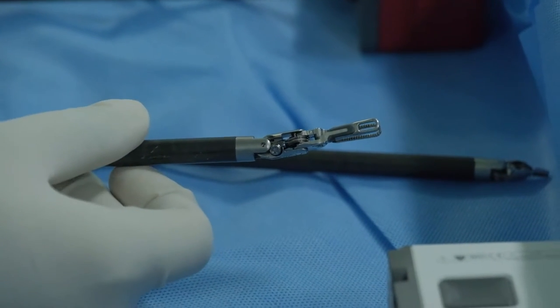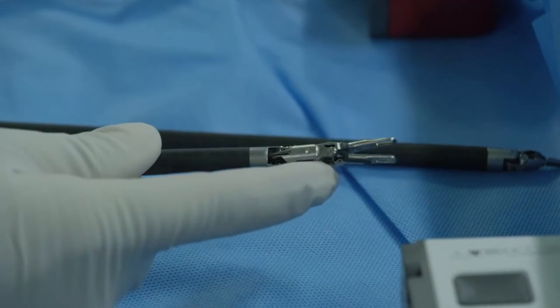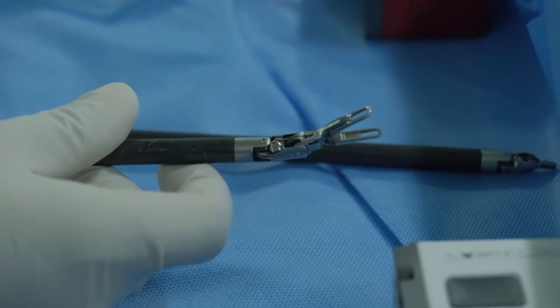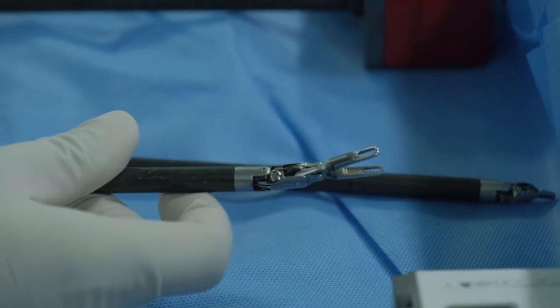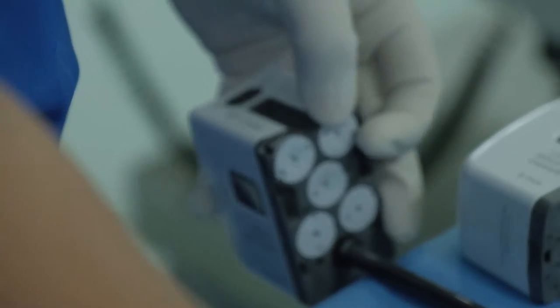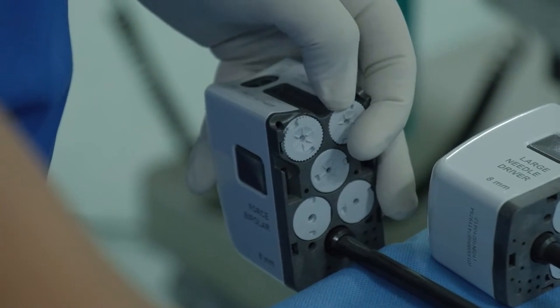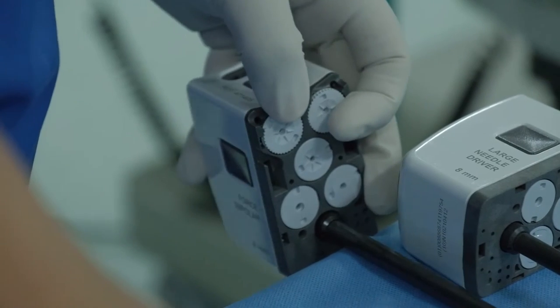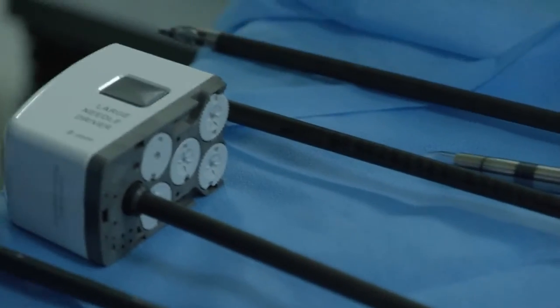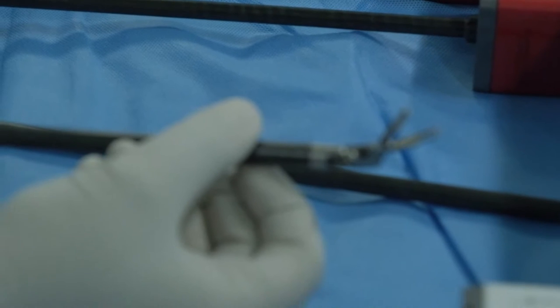So this is a force bipolar, and you can see there are fine wires and pulleys at the tip. And this is the beauty of these instruments, that these instruments are controlled by the discs. So here I am moving the disc from the top, and it is leading to translation of movement in the housing. These are actually connected through the adapter plate to the patient cart. And the patient cart is getting the signal from the master console through the fiber optic cable, which is leading to translation of movements at the tip of the instruments.